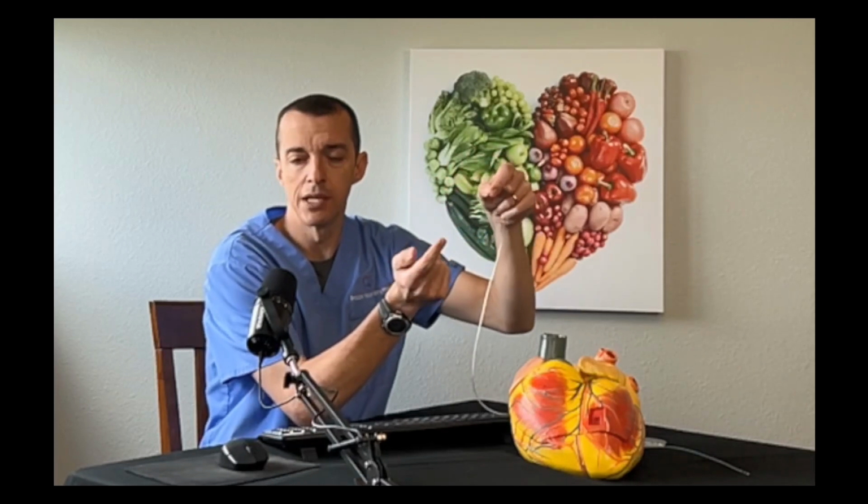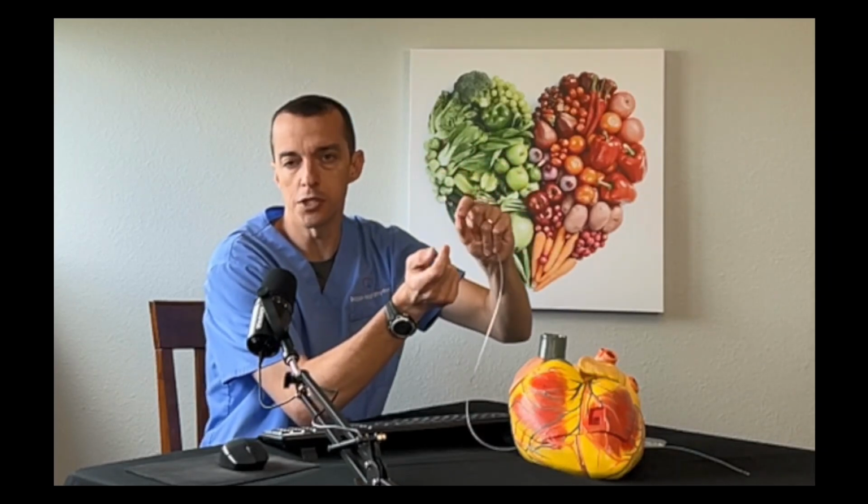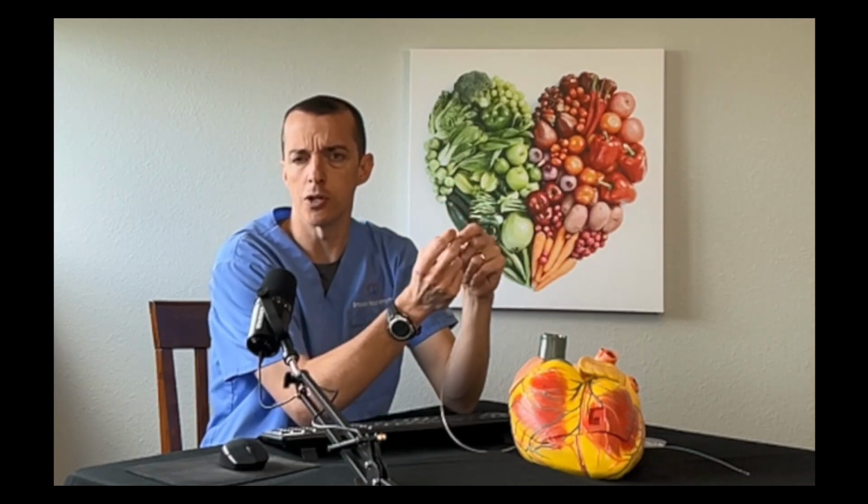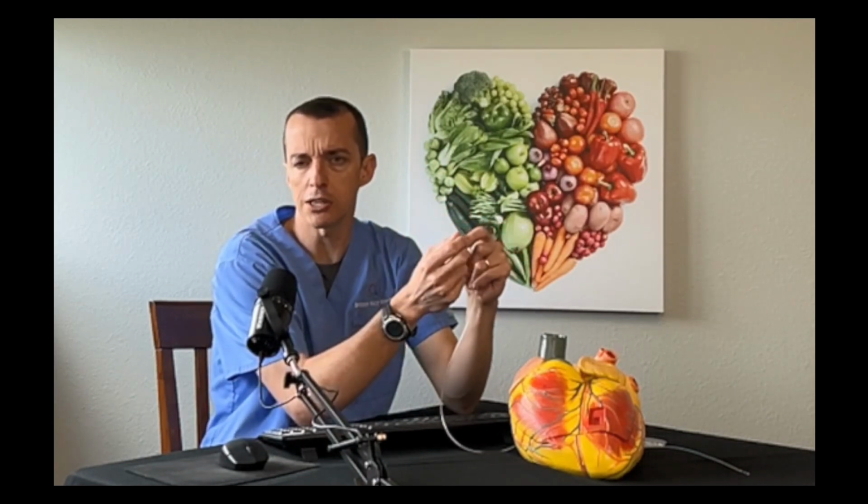It can be harder for the pacemaker to work, or maybe it doesn't work at all. It can chew through more voltage. It can run down your battery a lot faster. Again, that might not be something you're aware of. It wouldn't be until we check the pacemaker that that might or might not be apparent. Obviously, if the pacemaker fails because it's not capturing, then you would be aware of that.